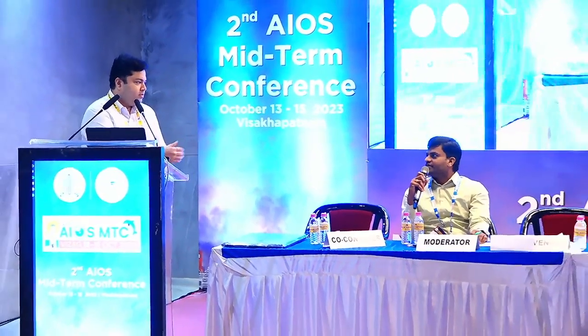Nice presentation. UBM or OCT, which one is better? Both are equal. So we correlated that. You get more crisp images with the OCT, especially in the anterior segment. UBM again may not be available in all centers, whereas OCT now comes with the package. So to be honest we do not find any difference between the two.